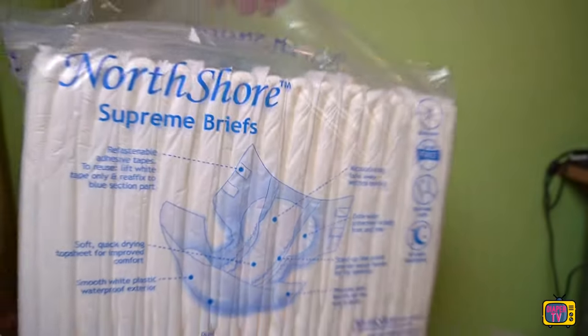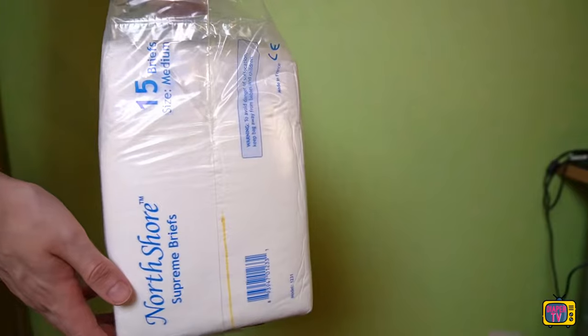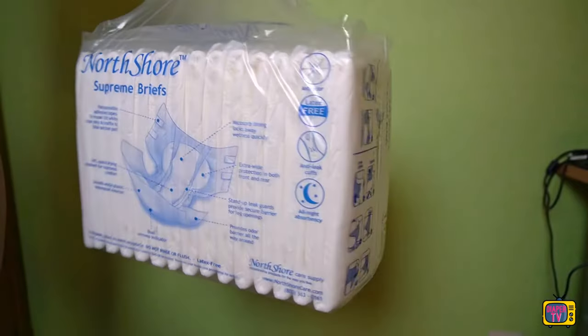The brand, on the other hand, is well known, especially through the Megamax — a diaper that is quite absorbent and can be bought in different colors.